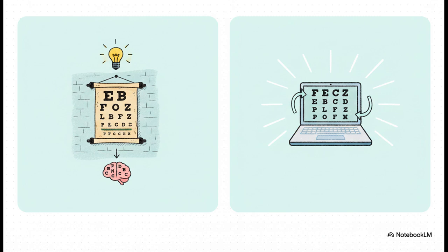And maybe most importantly, digital charts can randomize the letters. So that patient who comes in every year and has the fourth line memorized, yeah, that doesn't work anymore.